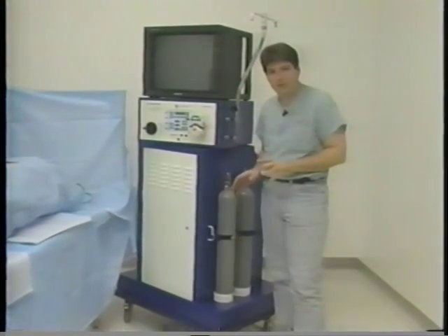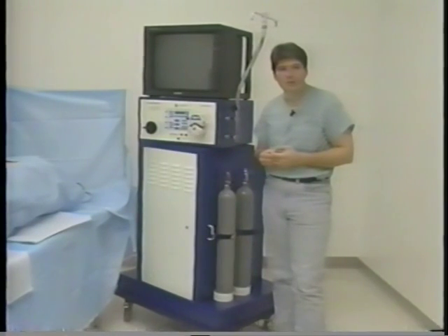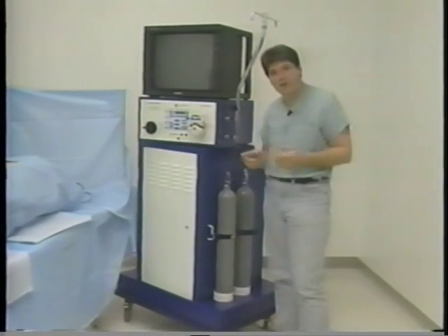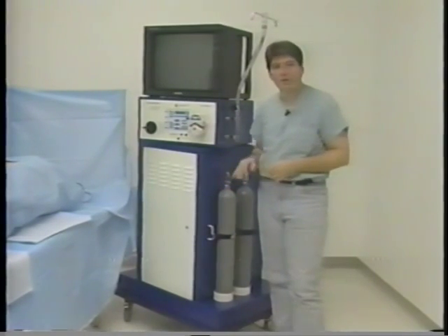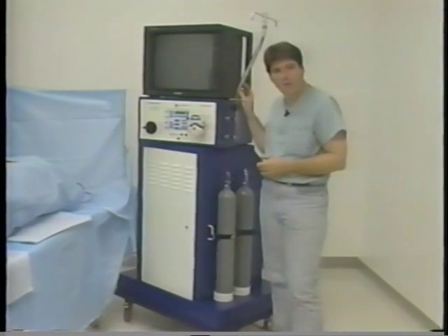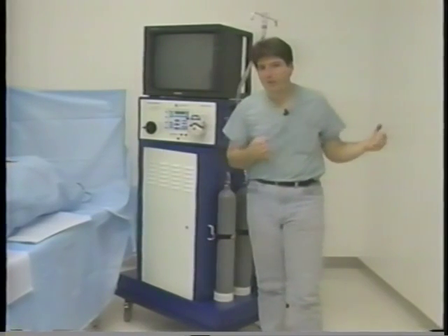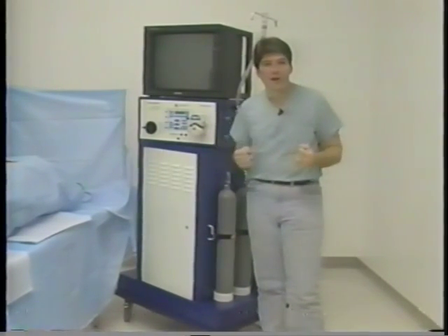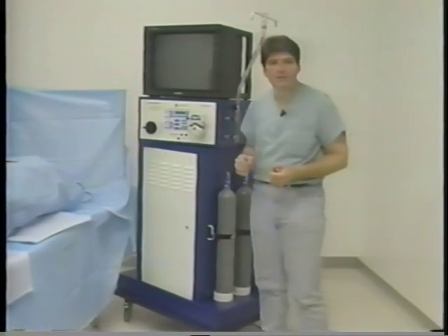Another benefit to this system is that we've incorporated several things that make your job a little easier if you're the nurse or the technician. We've built the CO2 bottles right under the side of the machine, with a dual bottle system so that when one bottle goes empty, you'll automatically have a replacement. We've even incorporated an IV pole — just today I was in surgery having problems with the IV pole dragging it around trying to chase the system. If you had this system, you wouldn't have that problem.